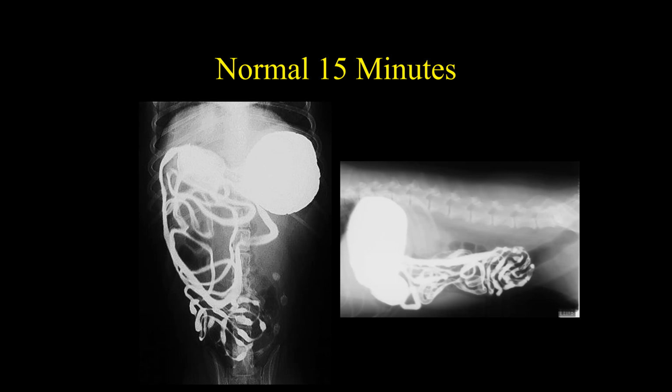Now realize all of this small bowel, like right in here, you can see a portion of the small bowel that is thin. Okay. But all the bowel has peristaltic motion. So most likely that's just an area of the bowel that is undergoing peristalsis. Okay. So the key when you're looking for defects on contrast studies is if you see this area here that's thin and you think, well, maybe he's got a stricture in there, you want to make sure it's repeatable at the same spot over multiple time frames. Okay. So seeing a potential lesion, the key is let's look at that lesion in the bowel and see if it's repeatable over time in the same spot.